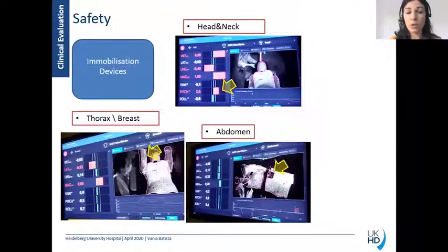For the patients that need abdominal compression, you can also adjust the plate position and the pressure between the press and the patient along the setup time. That also saves time again, because then you only need to do a cone-beam CT and confirm that you have exactly the same position as in the planning CT.